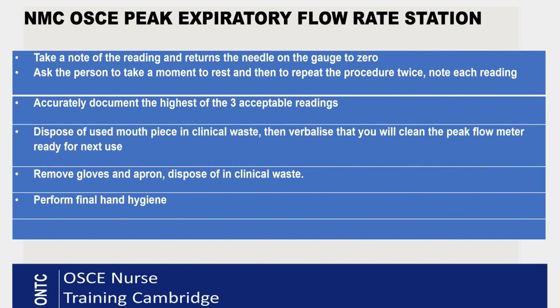So now you've got your 3 readings. Straight away figure out which one is your highest reading, and then add that to the final reading column. So that's your final reading. Make sure that you print your name and your signature and the date on the form, because that's required to pass, to complete all your documentation.